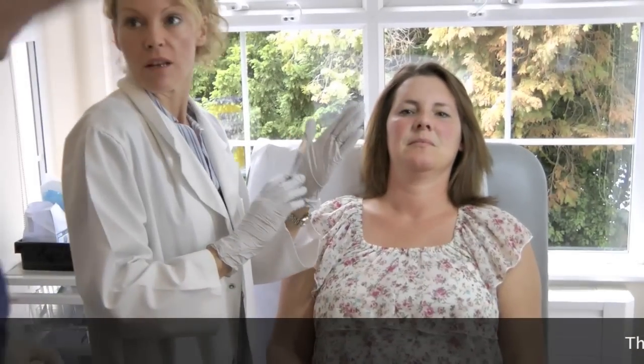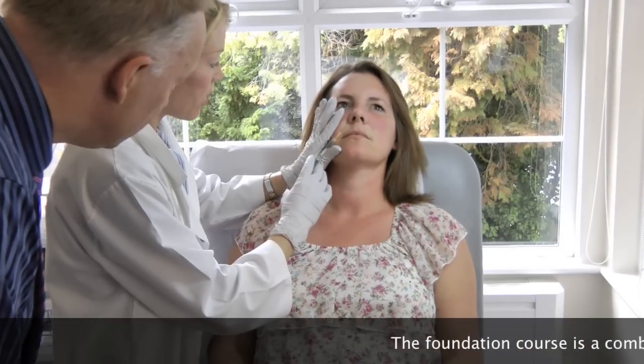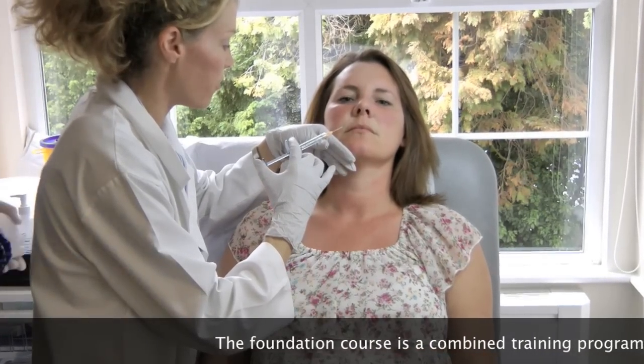The first thing I'm going to do, because I'm using the needle that I prefer, is measure up. So we should be able to cover all that area without going in a second time. So because I'm using Juvederm 4, I'm going to go in at a 45 degree angle, so I should support myself to go in.